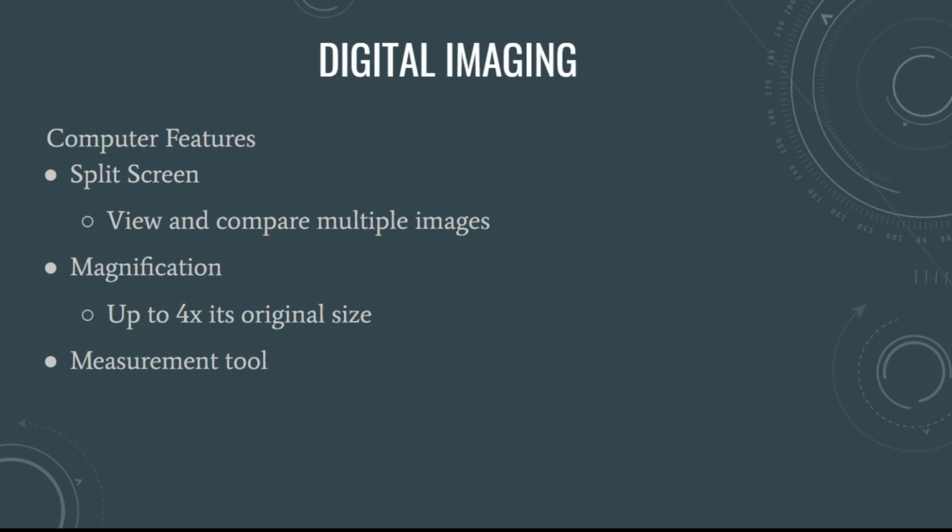They offer different measurement tools. So if you need to measure the length of the root, this is useful for endo and implants again.